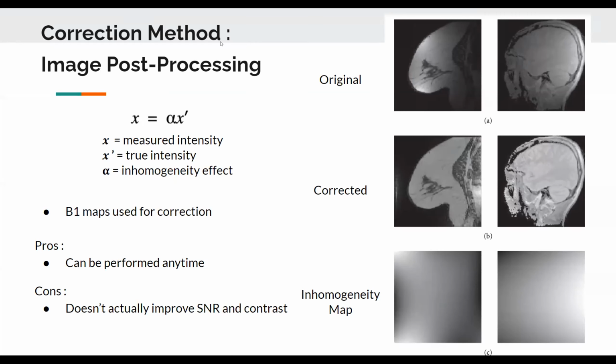So clinically, do radiologists do it? Yeah, there's actually a way on the scanner. There's like a button, optimize. If you're seeing a lot of trouble, then there's a way to optimize and shift those around, and that will do B1 shimming.